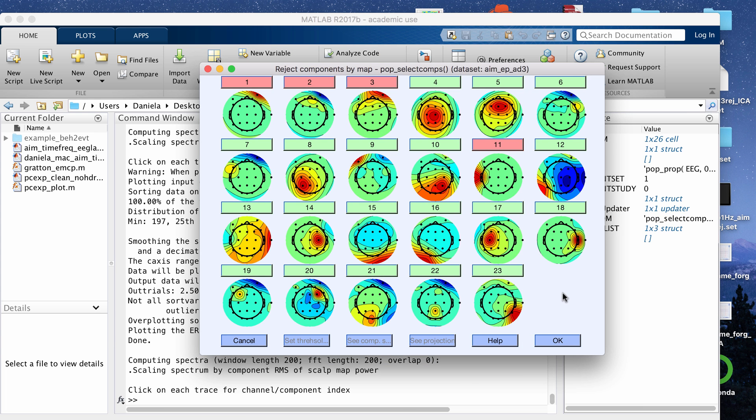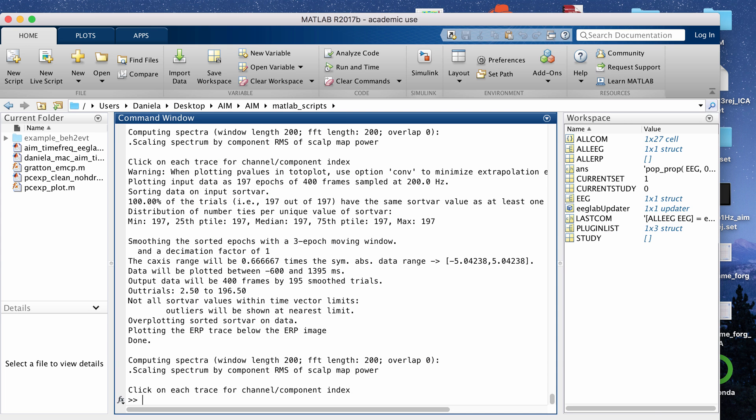I'm going to just leave it there and then just test out what the signal looks like after we take out the artifact from these four components. I'm going to click OK.